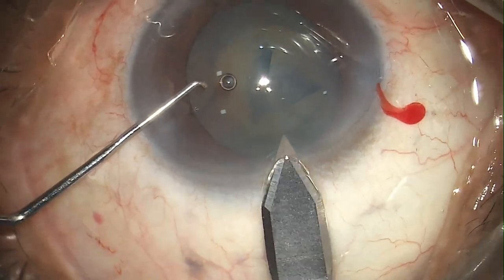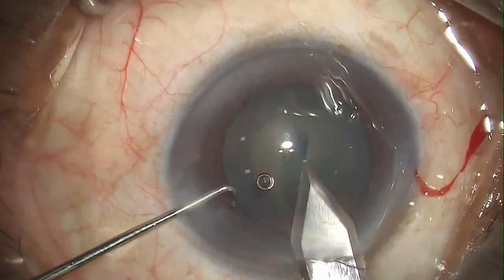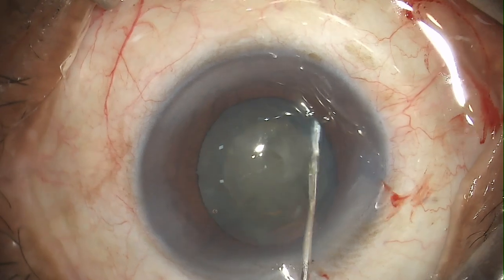Here I'm using a 2.8 millimeter keratome to make the main incision. Then I'm going in with the hydro cannula to perform the hydrodissection.